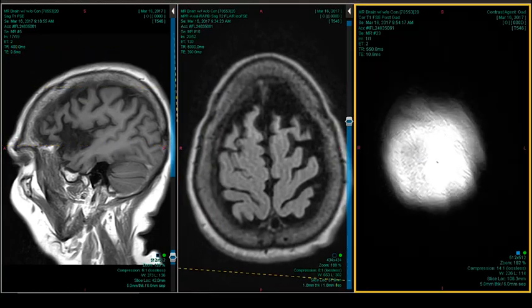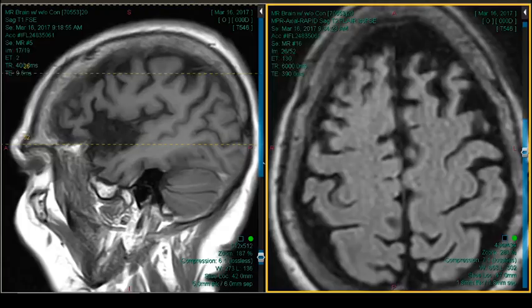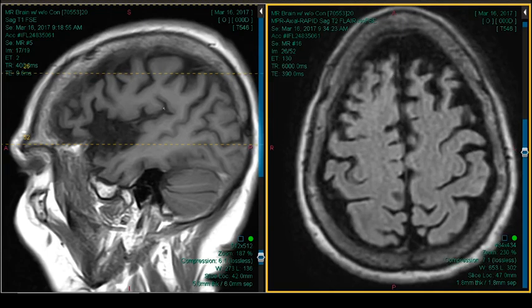Okay, so the thing we want to start doing, if we want to really help the clinicians, is start to think as they do. When they ordered the scan, what I try to do is ask, what was their differential when they ordered the scan? And I try to put a conclusion addressing each of those things that I thought they were thinking, meaning tumor, no tumor. That's one thing you're thinking. Is it a big subdural? No subdural. Because let me tell you, clinicians are suspicious. If you don't address it specifically, they assume you didn't look. That's the world that we're in today.